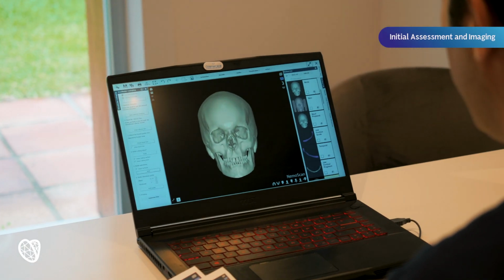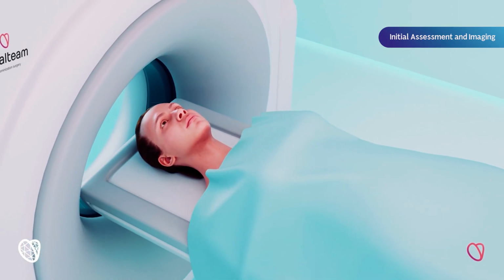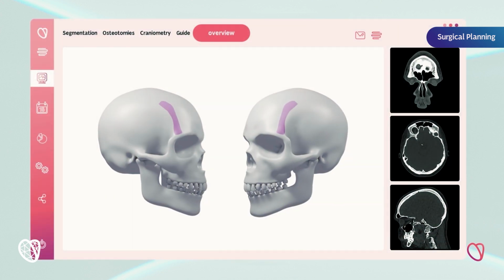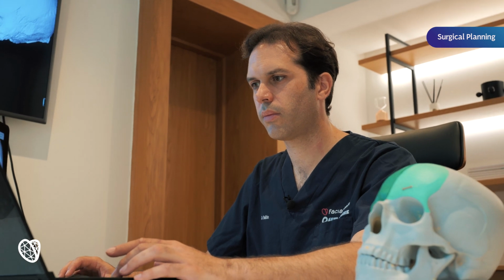Before starting the surgery today, let's jump back to one of the most important parts of the FOREContour technique, the planification. So let's see how it goes. The very first step is understanding really well the anatomy of our patient, how her facial structure is. So a 3D CT scan is conducted. With this 3D imaging based on the CT scan, we introduce the data in a very specific software where we plan all the details and all the surgery.